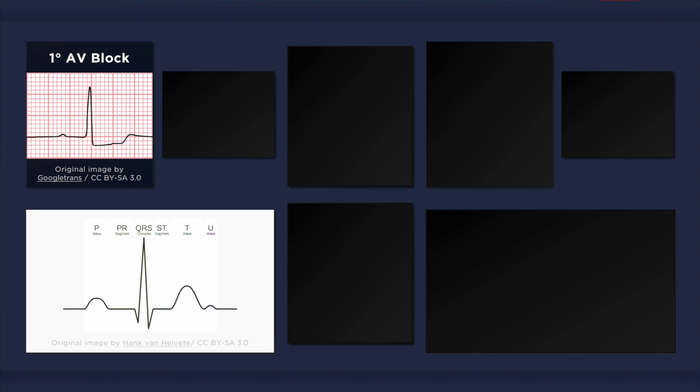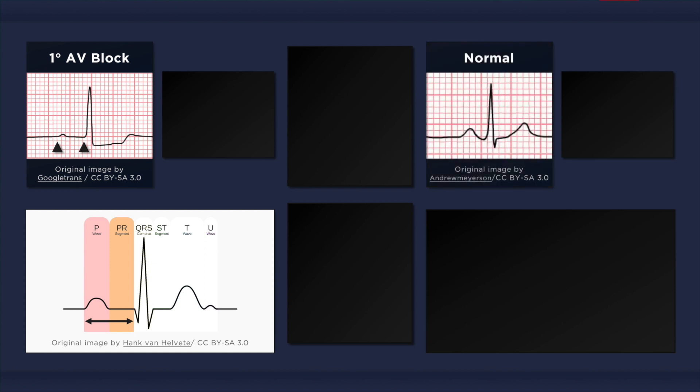The PR interval starts at the beginning of the P wave and ends at the onset of the QRS complex. Note that the PR interval includes the P wave and the PR segment. Do not confuse the PR interval with the PR segment, which is the isoelectric line that occurs between the P wave and the QRS complex. The ECG on the top right depicts a normal PR interval. To determine its duration, we simply count the squares from the beginning of the P wave to the start of the QRS complex.